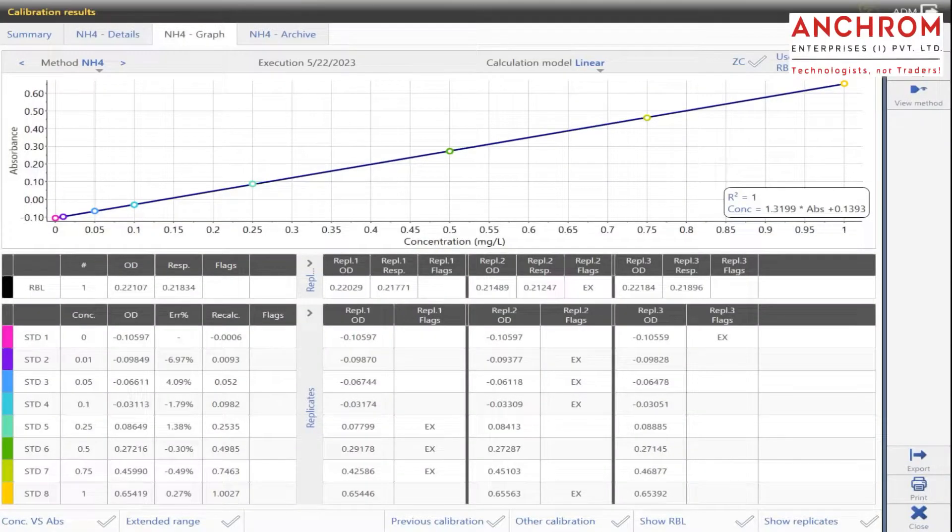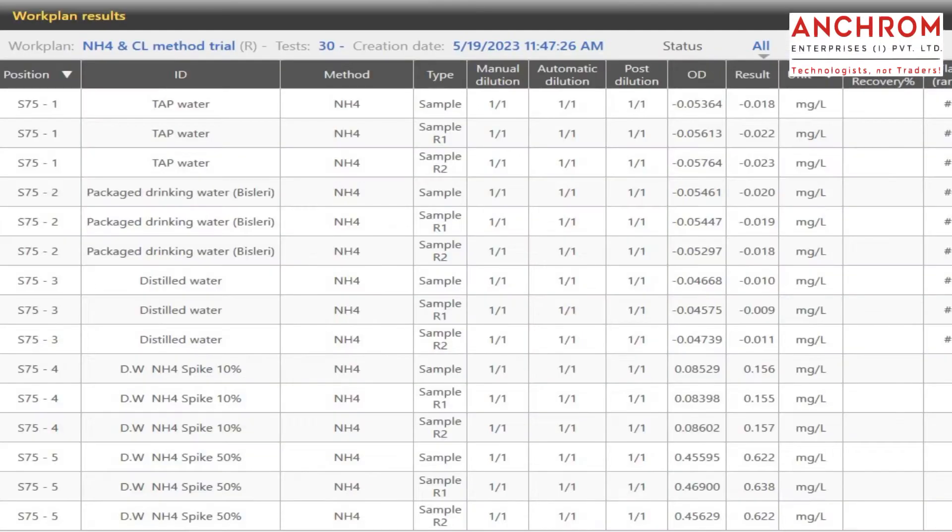Here you can see the calibration curve that is obtained from the analysis. The sample results are based on this calibration curve.